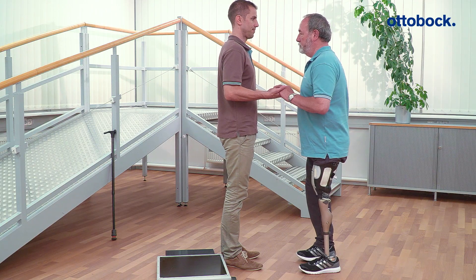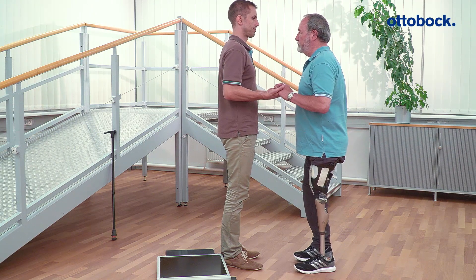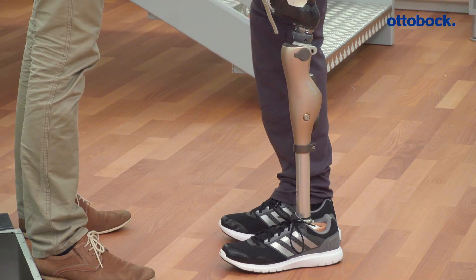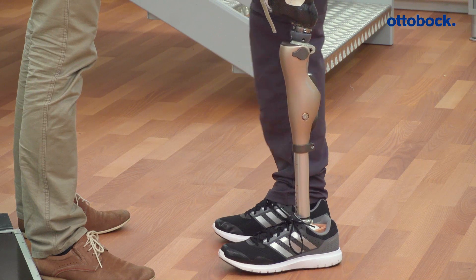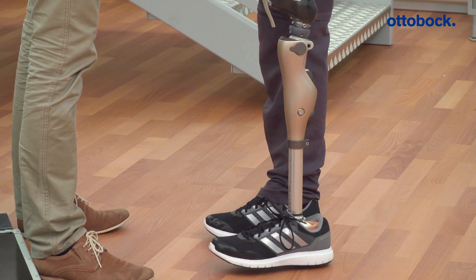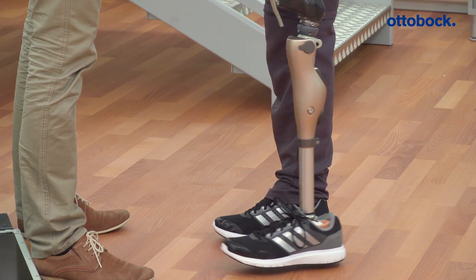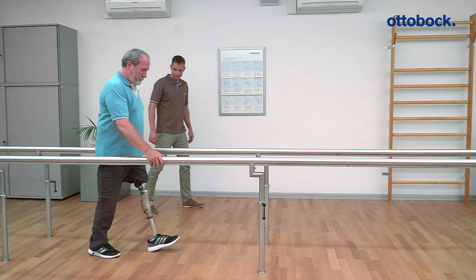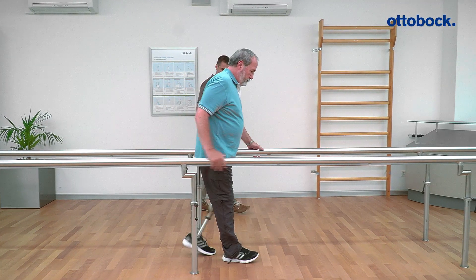You can also check the socket flexion angle by using the simple test shown in the video. If the toes are nearly at the same position, dynamic alignment optimization can be carried out. Dynamic alignment optimization involves fine-tuning the prosthetic alignment in the frontal and sagittal planes while the user is walking.